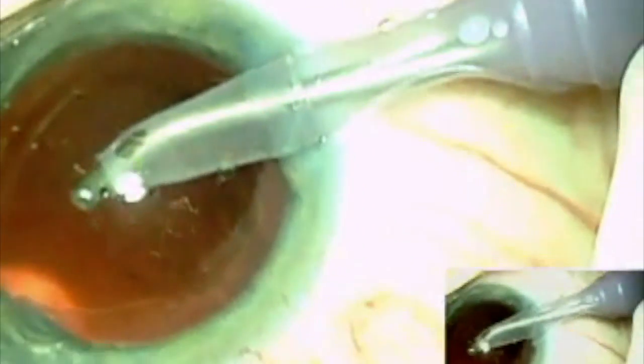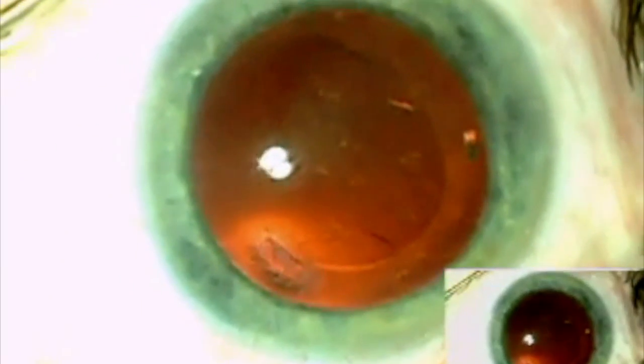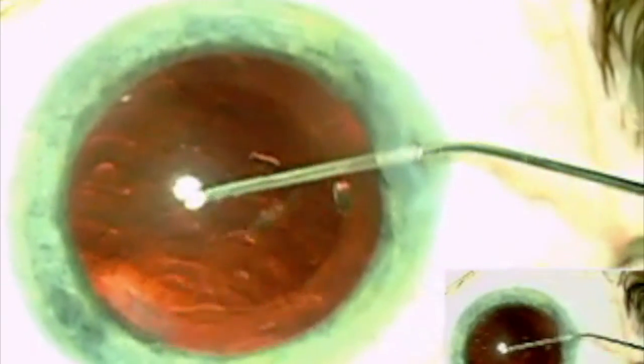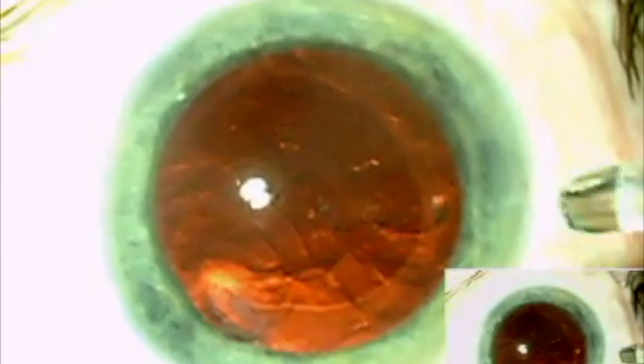Once the cortical cleanup has been completed, the capsular bag is inflated with viscoelastic and the intraocular lens is placed in the capsular bag.